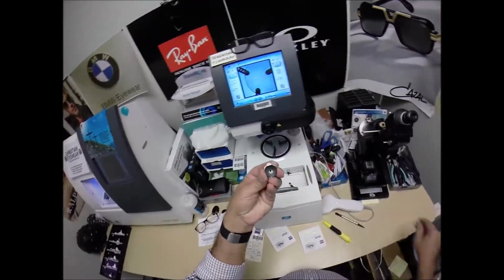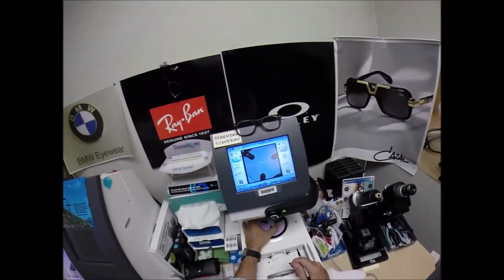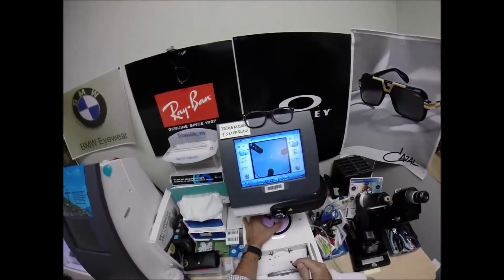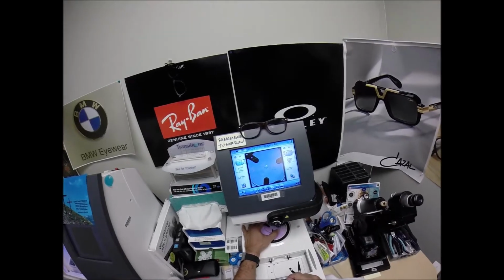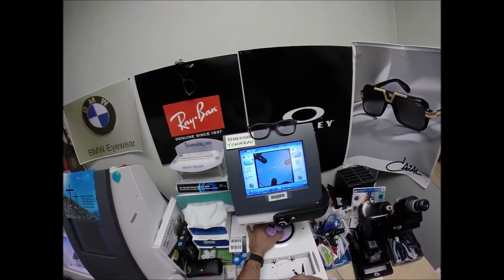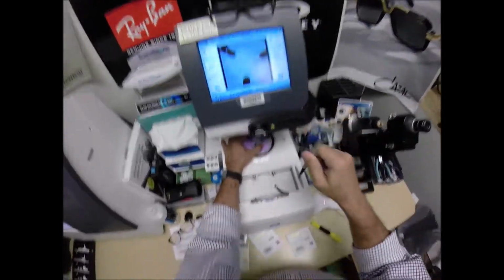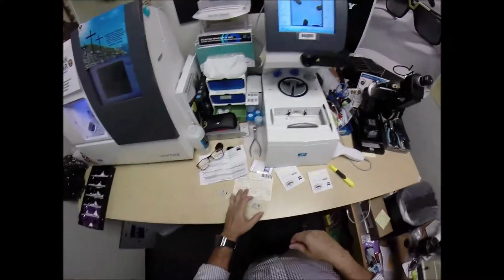Pull the paper away to make the black side sticky. Line up the magnet there. If these were different pupillary distance, I would enter that data now. Keep the same optical center height. Get everything laid out. And hit that button. The arm comes down, places the block onto the left lens.